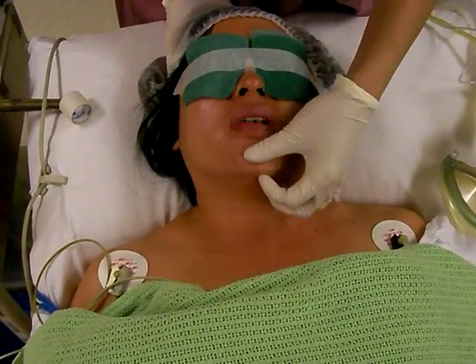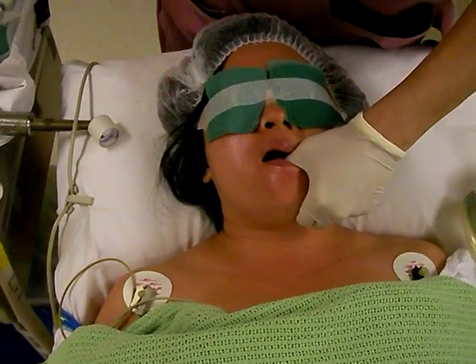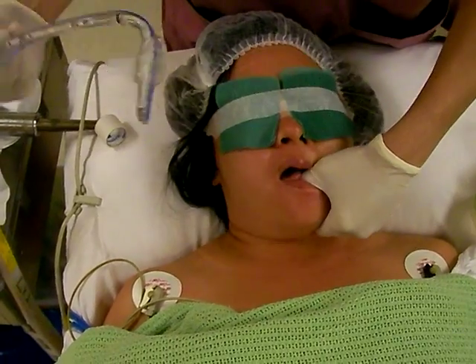Then you open the patient's mouth. Use the left hand to provide a powerful jaw thrust. And then you use the other hand to insert the traclight.